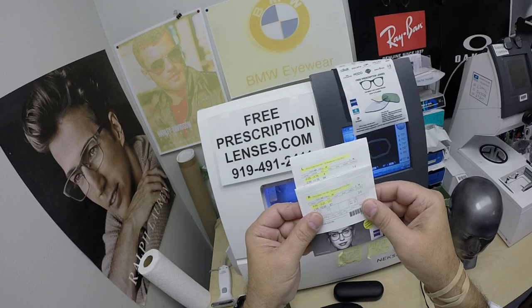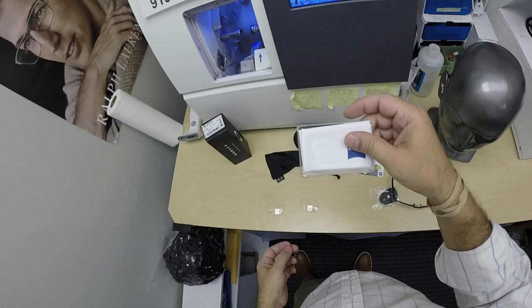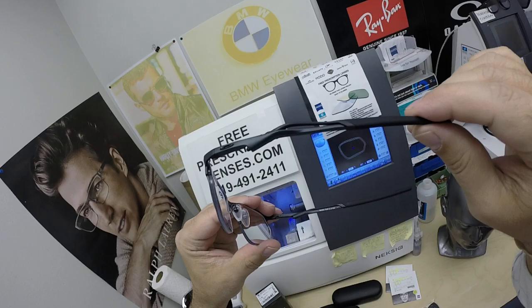He got the Zeiss polycarbonate — Photofusion, 1.59 refractive index — the Photofusion Gray, the new X edition with DuraVision Platinum. I've highlighted the prescription for the right eye, same for the left. You're also going to get the Zeiss cleaning cloth, my premium microfiber cloth, and instructions on how to care for your frame, lens, and all three cleaning cloths, as well as your case, so those will last you for years.